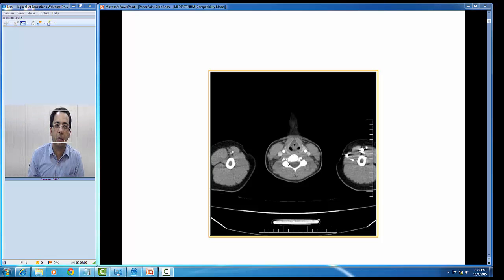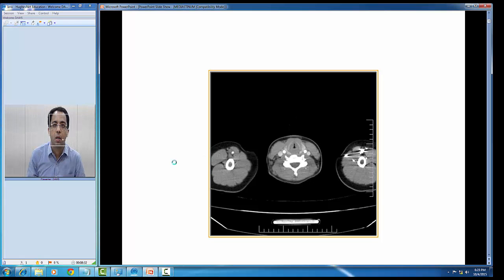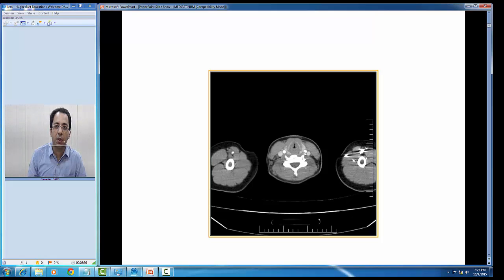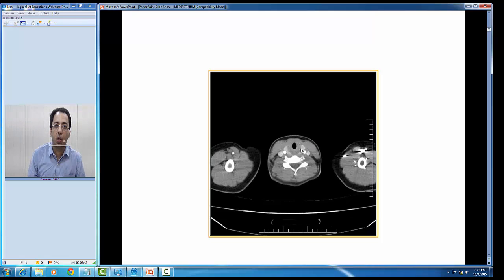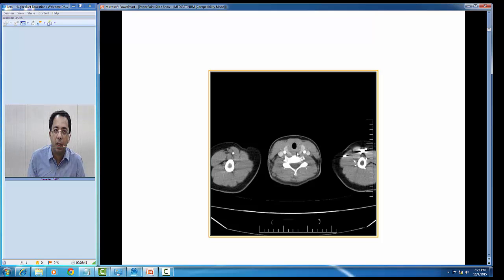You can see the cervical vertebra, larynx, common carotid artery, and the internal jugular veins, and this is the sternocleidomastoid muscle. As we go further down, we are able to appreciate the common carotid artery, internal jugular vein, and the sternocleidomastoid muscles.